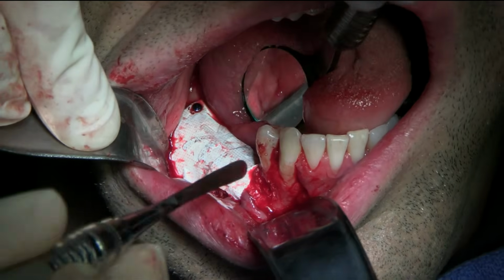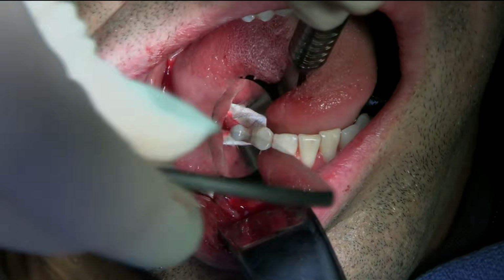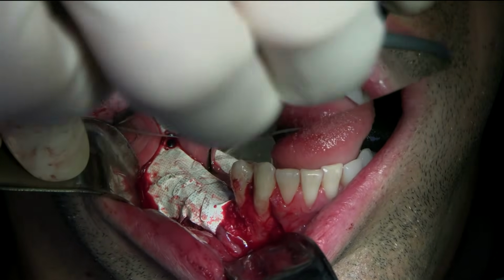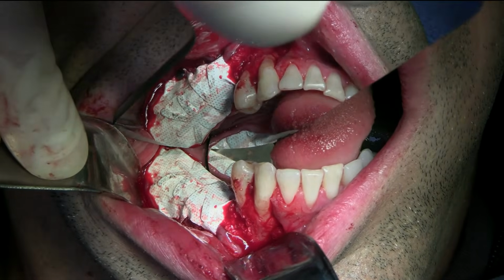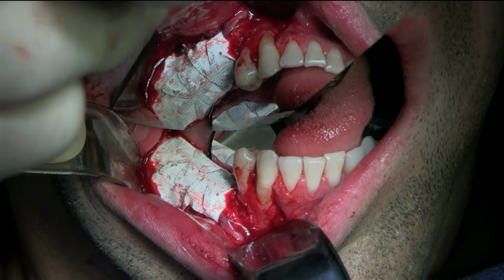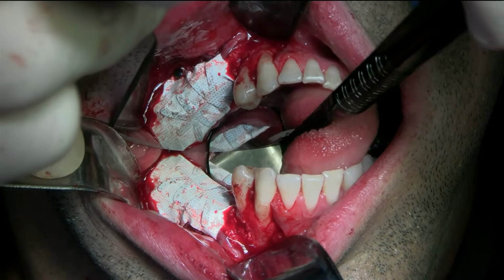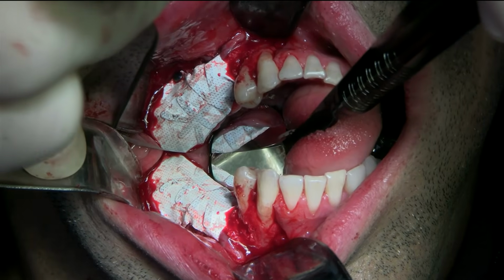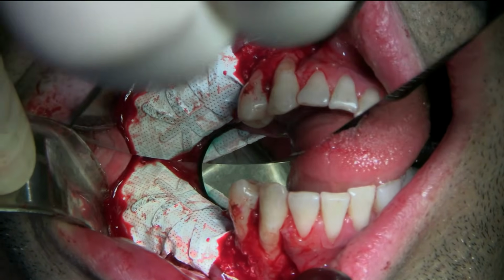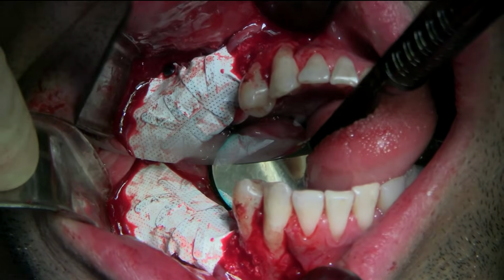Ready. There we go. Yeah, that's good. Yeah, zoom in. Perfect.